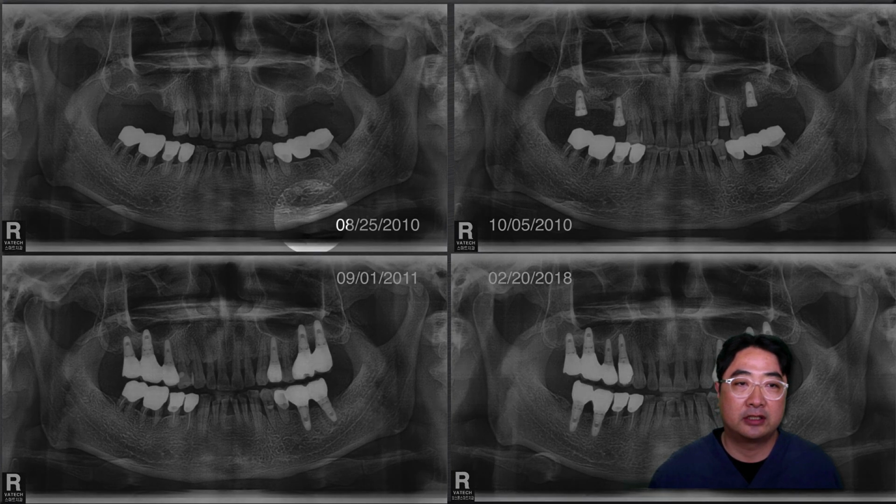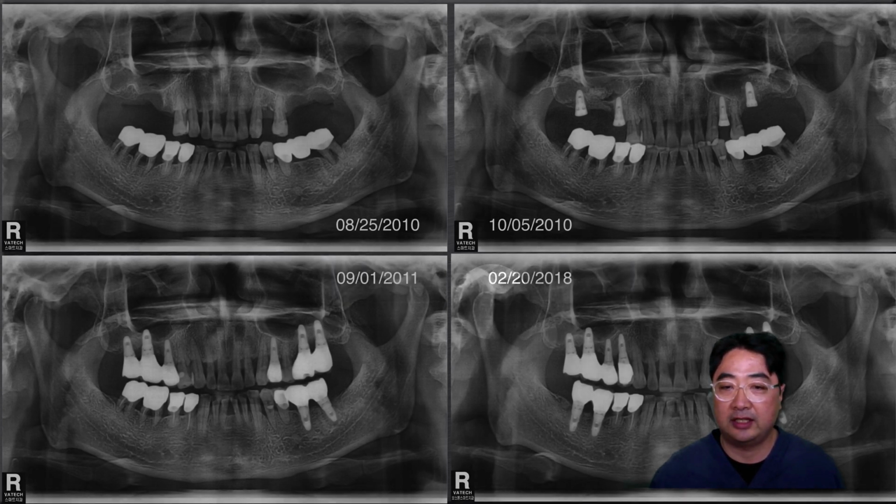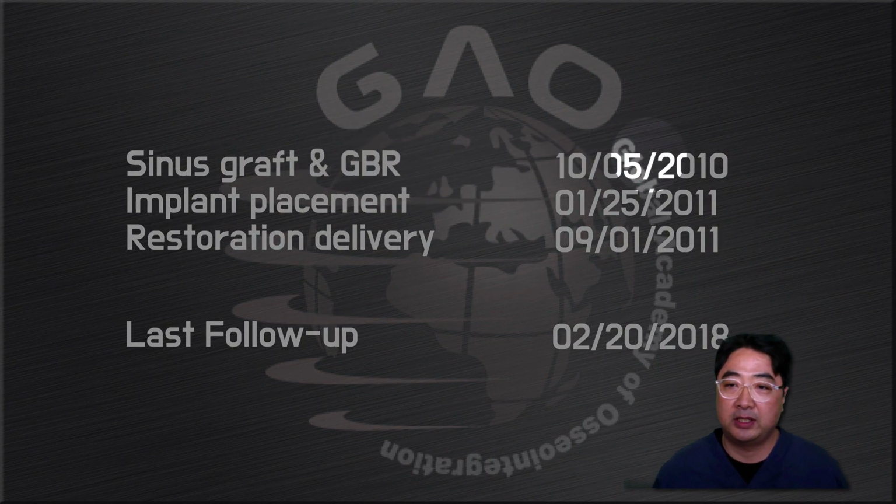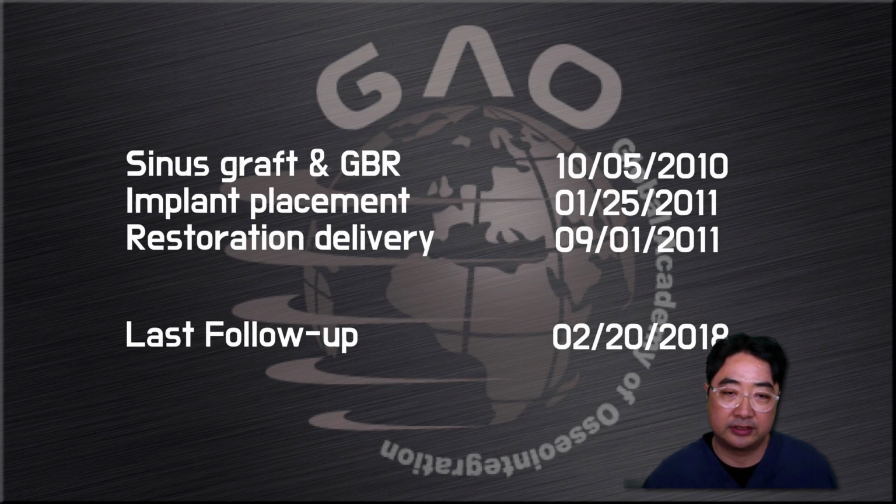So this is how I started. This is a panoramic radiograph after extraction, on the day of the sinus graft and the perforation repair. This is when I delivered the restoration, 2011 September, and this is the recent follow-up, 2018 February. From the sinus graft and GBR, it's been about 7.5 years, and from the restoration delivery, a little more than 6 years.